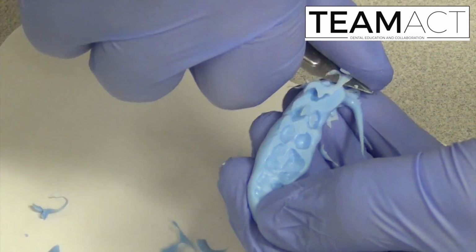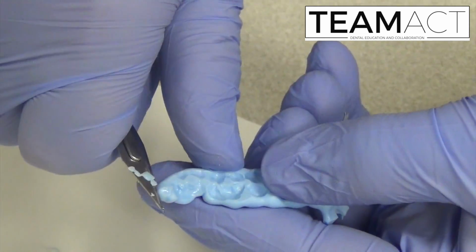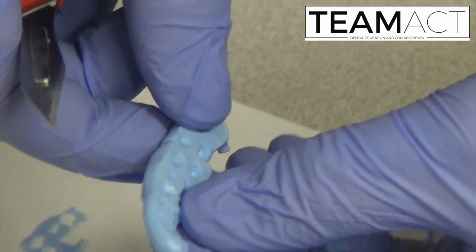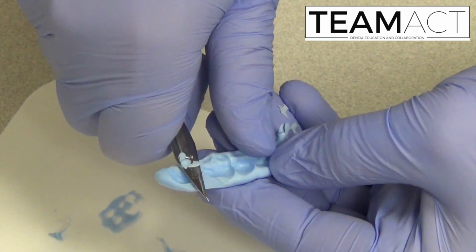I do this in order to help make sure that these records seat fully between the diagnostic casts we've received earlier. This will improve the accuracy of the CR mounting in our articulator.